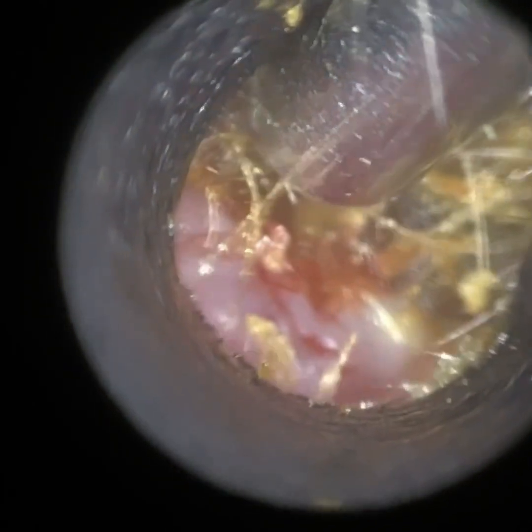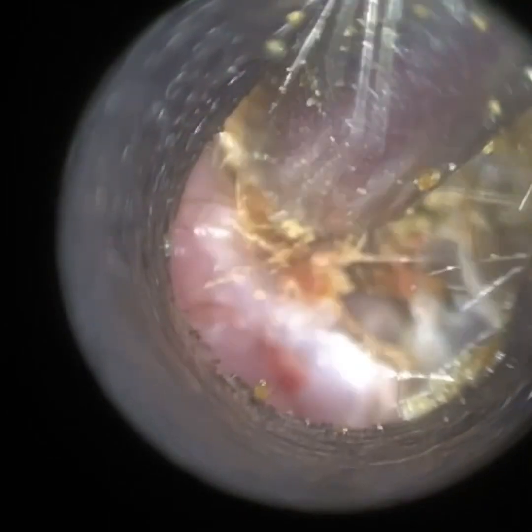You can see there's a bit of blistering at the bottom. When you remove dry wax like this, which envelopes the skin, as you remove some of the wax, the skin detaches itself from the canal wall and it can cause a bit of a blister and sometimes even mild bleeding, but it's very minor there. And you can see by the end of the procedure that's completely stopped. You can see the skin there where we're lifting it — there's still a bit more skin on top.